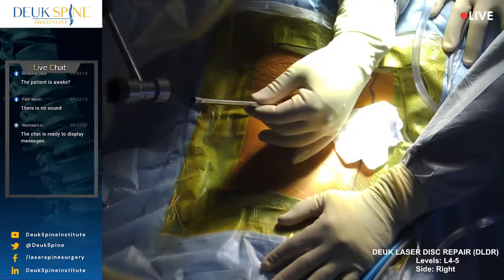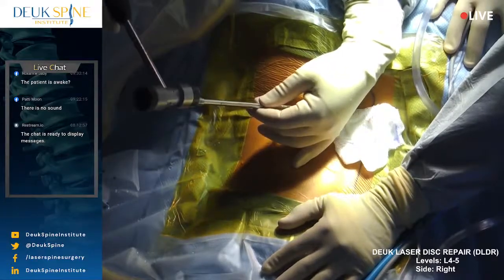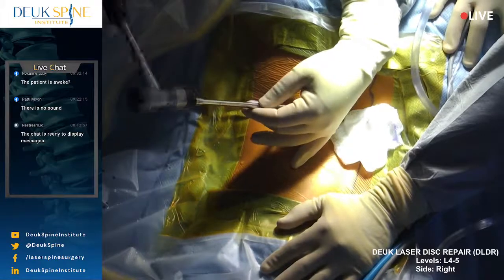All right. We're making progress. We're putting our tube down so we can do the surgery. Why don't you show them what we're going to be doing once we get this tube in? Let's run the next animation.